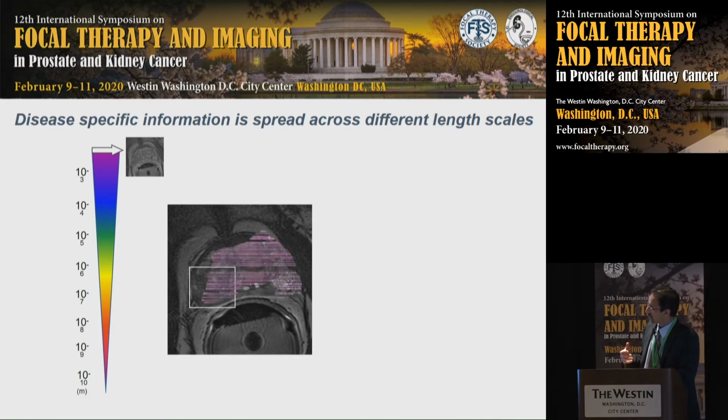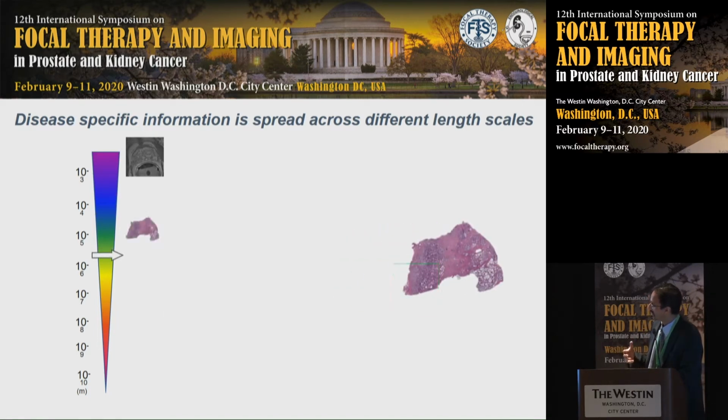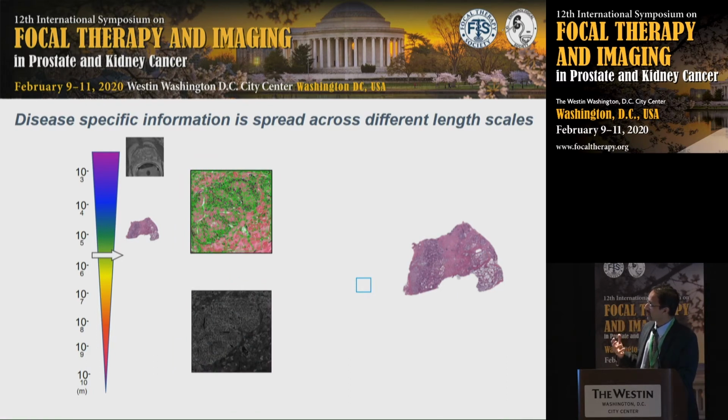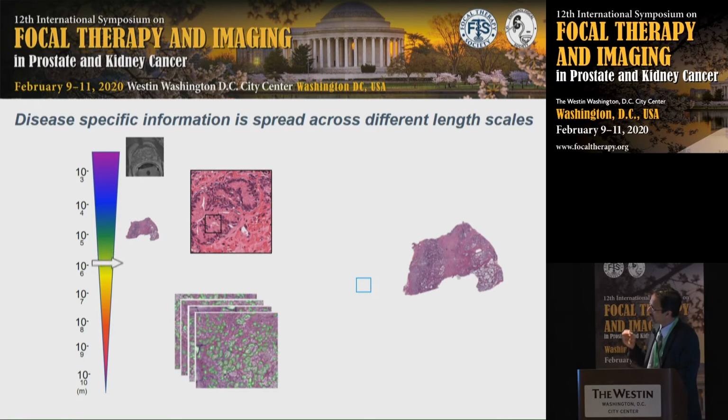If this patient were to go on to get a radical prostatectomy, now with whole slide scanning and digital pathology technologies, one can digitize the surgical specimens. And in their digitized form, one can now start to apply AI and computational image analysis tools to really interrogating the morphology of the tumor in a very quantitative and a very reproducible way. And of course, because one has digitized the pathology, one can also start to look at features relating to the shape of the individual nuclei and the individual cells in the pathology images.